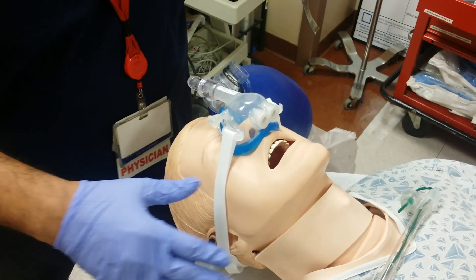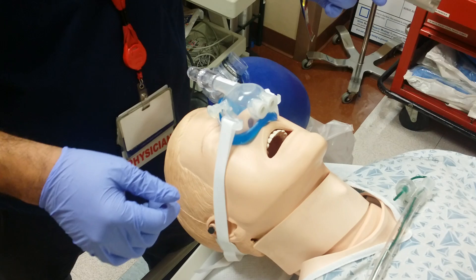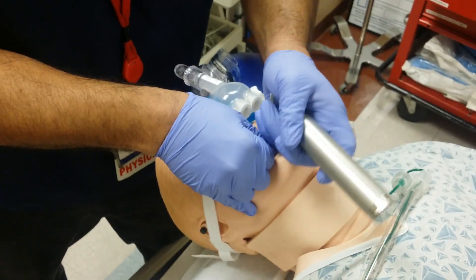I've already positioned him with external ear-to-sternal notch positioning, and the medicines have gone in. He's paralyzed and sedated. I'll proceed with intubation.